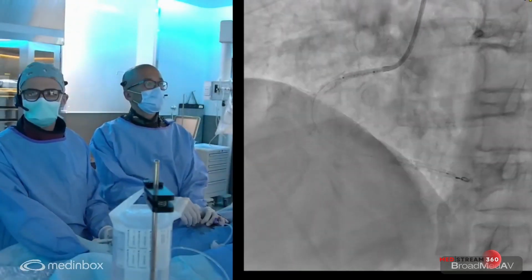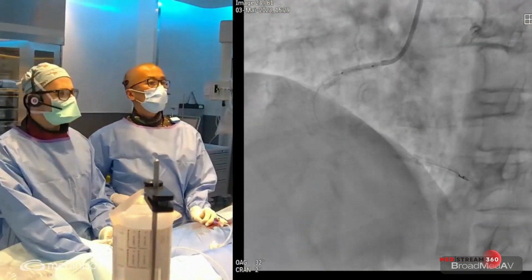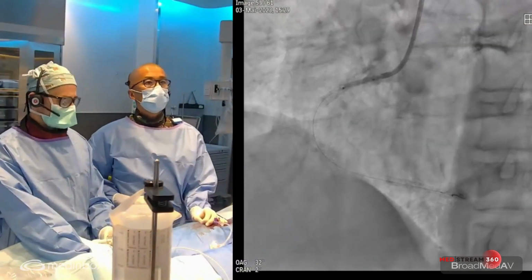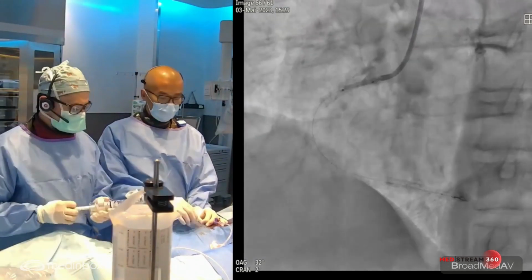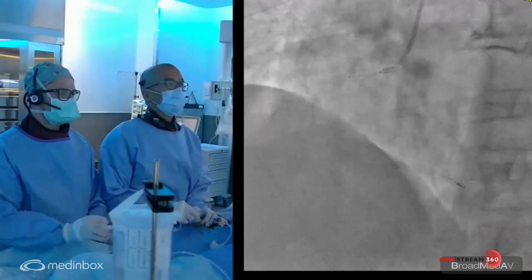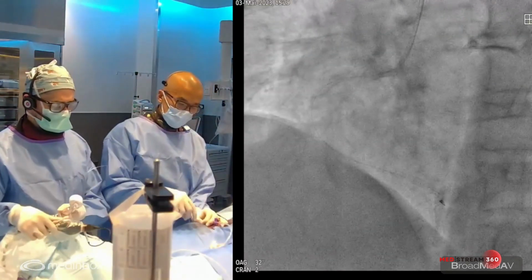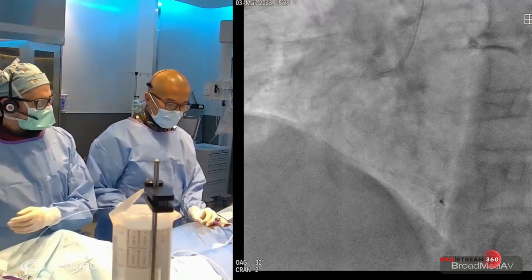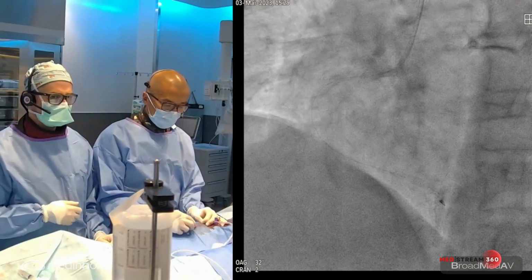This is the 6th treatment. So we already gave almost 60 shockwave treatments out of the 80 that is allowed per balloon. So we delivered 6 therapies. We'll keep 2 in case we have trouble delivering the equipment. So it's really optimizing, and then with OCT, the MLD max approach.